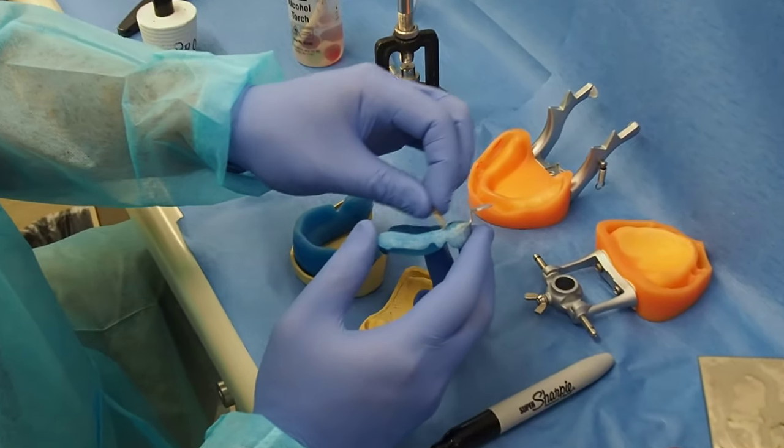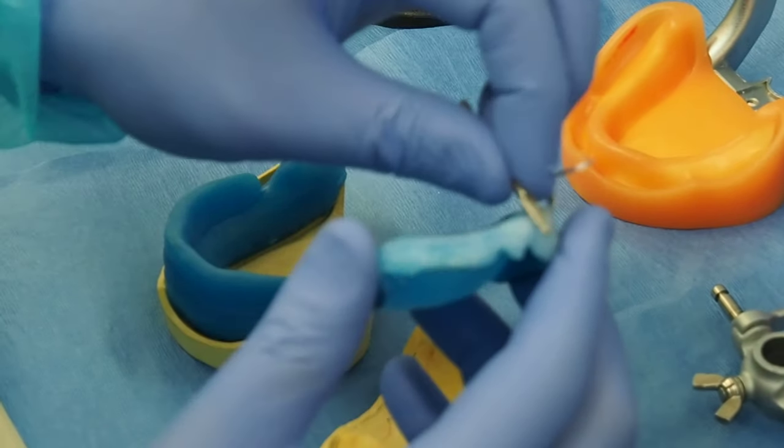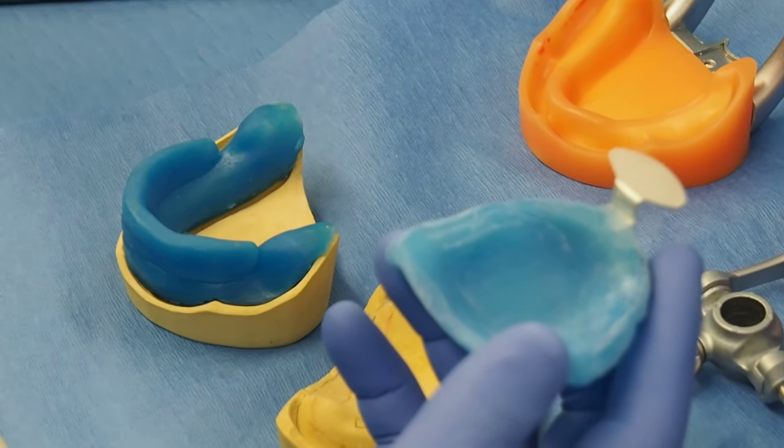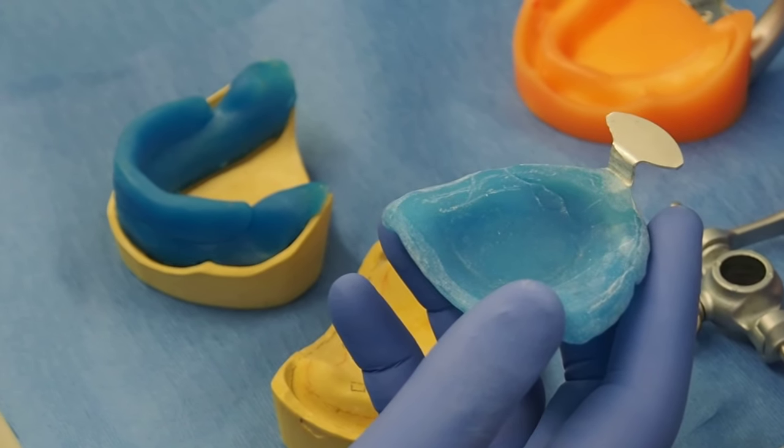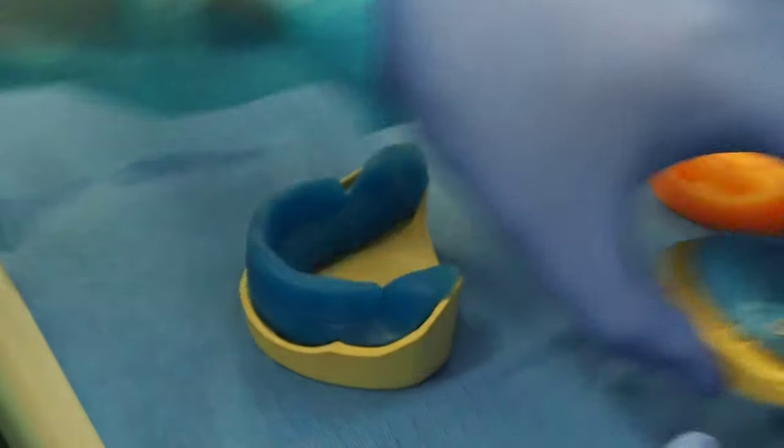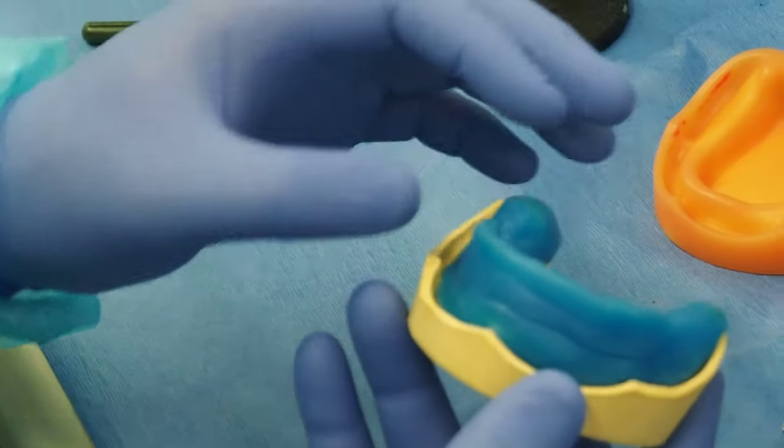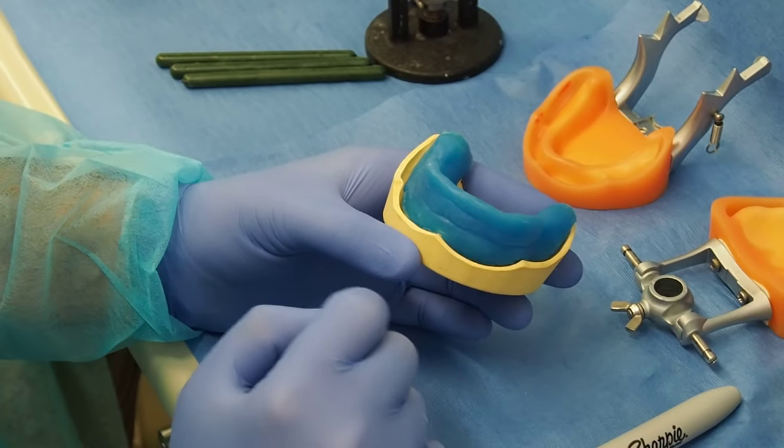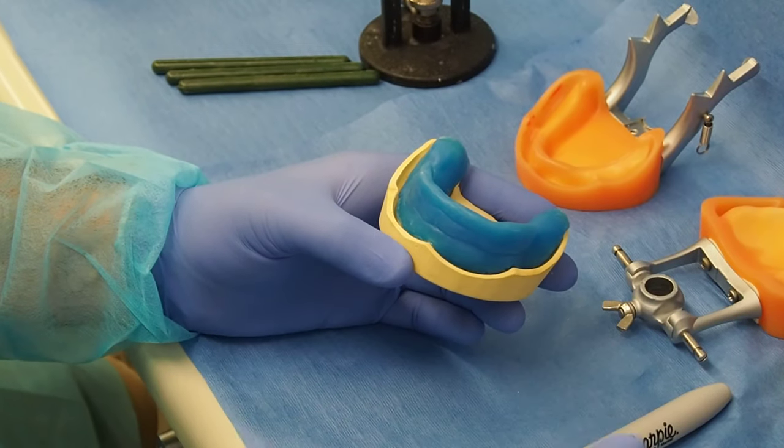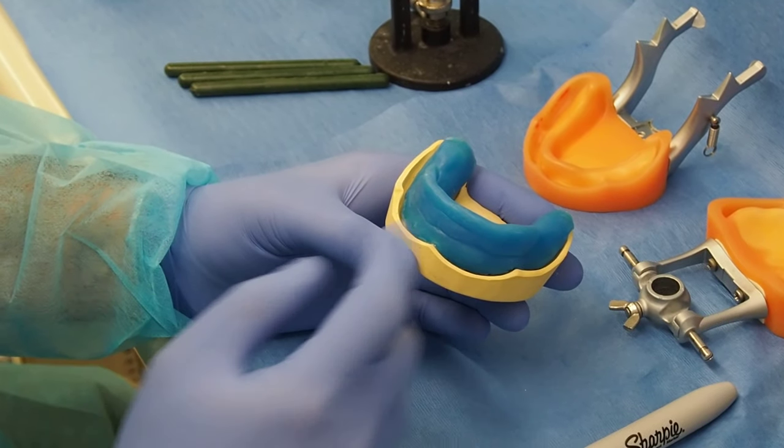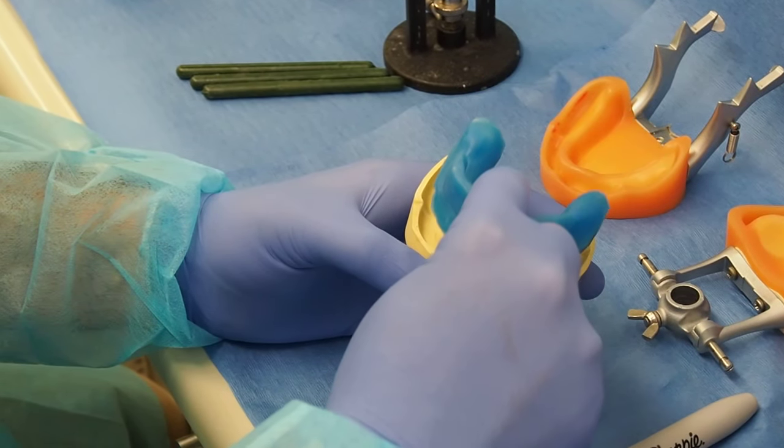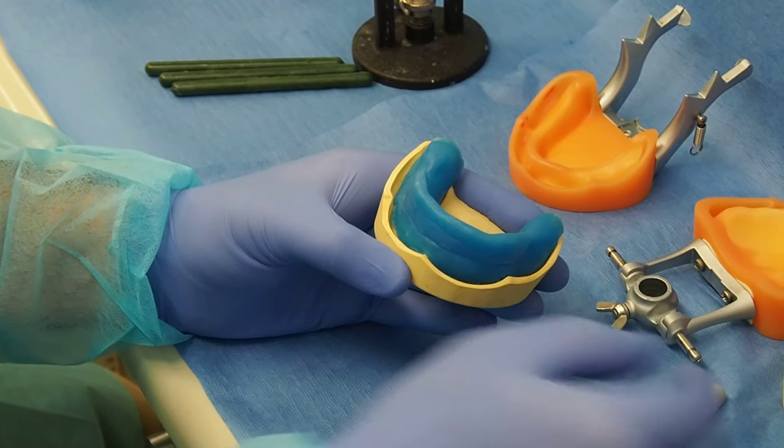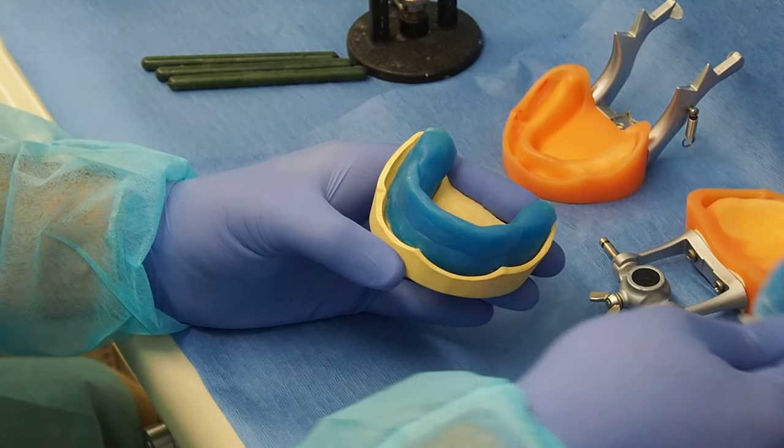Now if I look at the lower one I just made, you will figure out this one does not have a metal handle. There's many ways to fabricate a lower one, and this one is very easy to take on and off and also use it as a finger rest. You can either do a metal handle or you can just make something like within here.